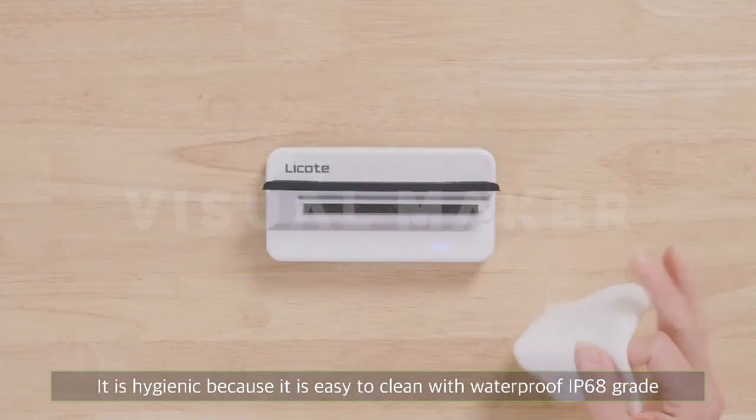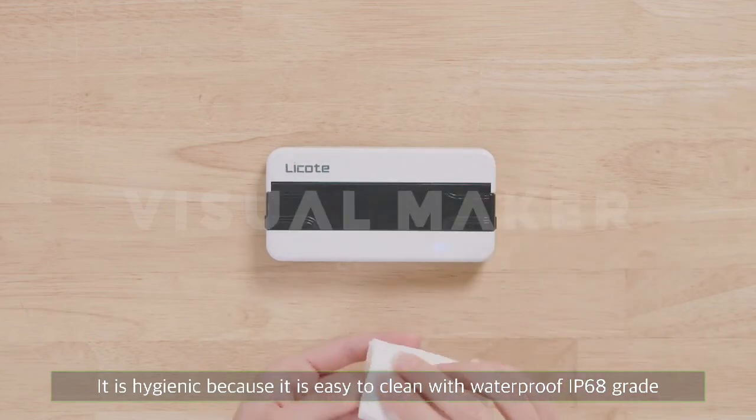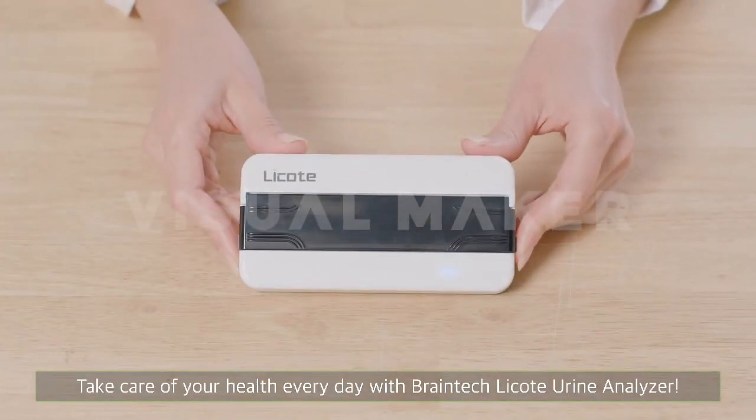It is hygienic because it is easy to clean with waterproof IP68 grade. Take care of your health every day with Braintech Licote Urine Analyzer. Enjoy your health always.